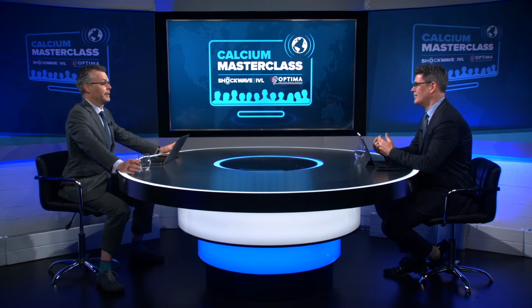I think it's highly effective, but at the same time, these are arteries which have undergone huge amounts of positive remodeling, and there is a limit to what the adventitia can grow to. I think we have to be pragmatic in our goals. So our goals will probably be more pragmatic than they would be in fibrotic or soft plaque, where we can aim for 90% of distal lumen area and so on. I think we have reasonable data from EXCEL, the sub-studies of EXCEL. I wish that had been done a little differently from the way it was done, but we have reasonable data that if we get to certain MSAs in the left main and also in the ostium of the circ and the ostium of the LAD, we can be confident of the durability of our results.